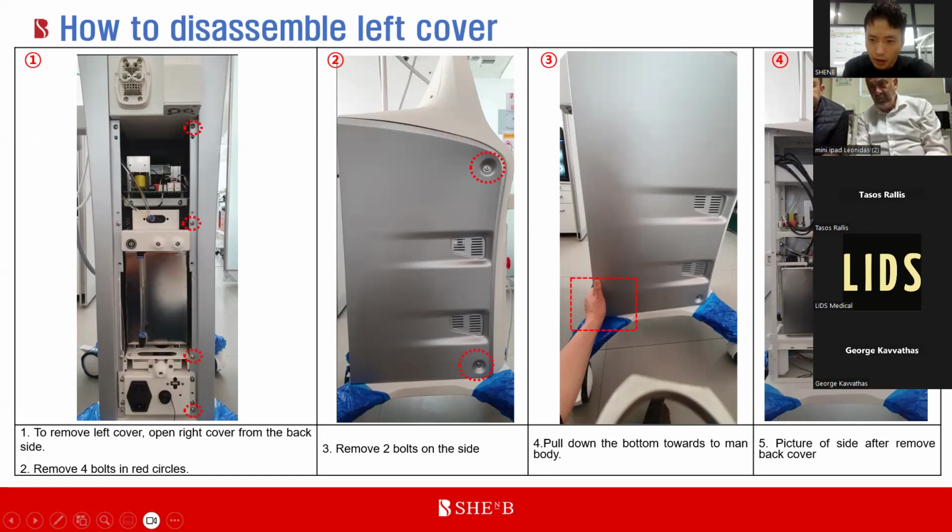And the upper part is all about the machine itself: the RF output, the user interface power, the machine power, and everything. The main board and the SMPS are also located on the upper part of the device. So if we have a power issue or a main board issue, we always have to check the top of the device.